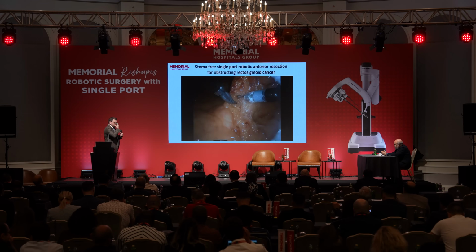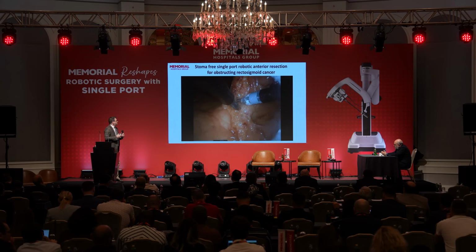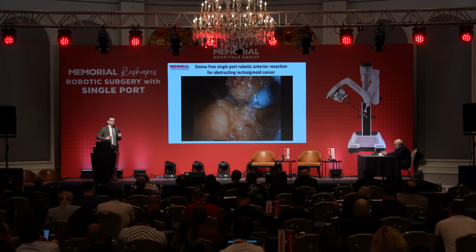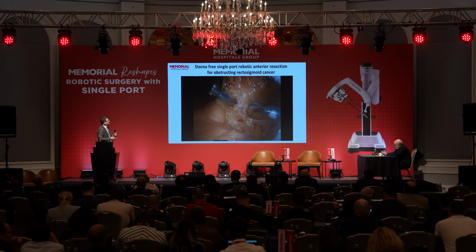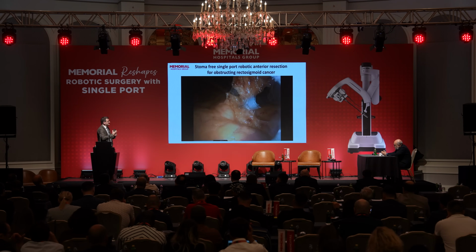What we notice in these patients, even for an obstructing tumor, is that you can access the abdominal cavity with a proposed area at the ileostomy site. And we didn't do an ileostomy in this case. So the advantages of the single port arms are related to the dexterity.